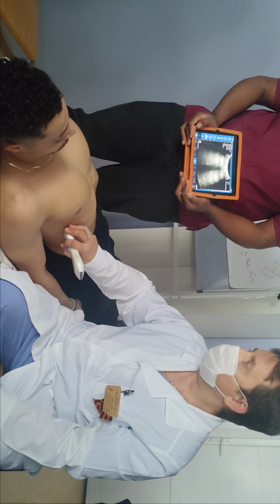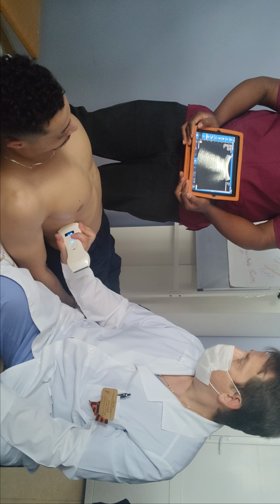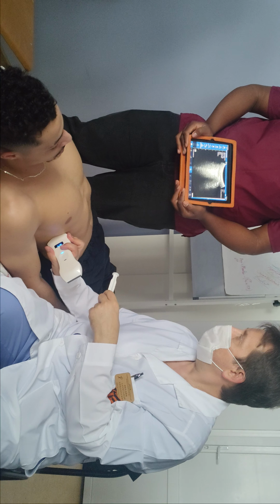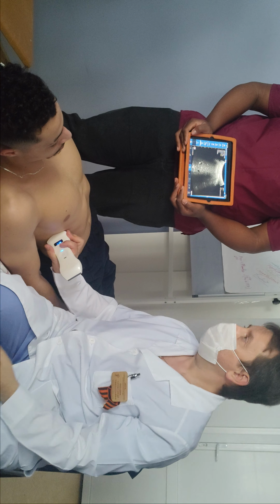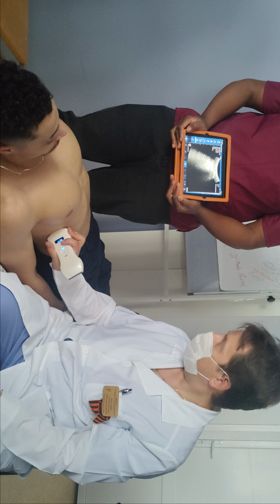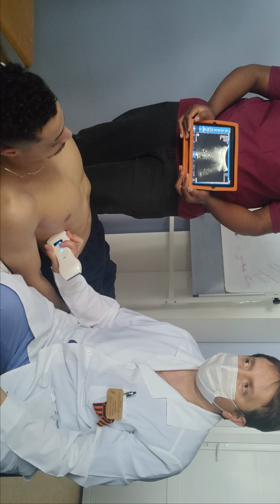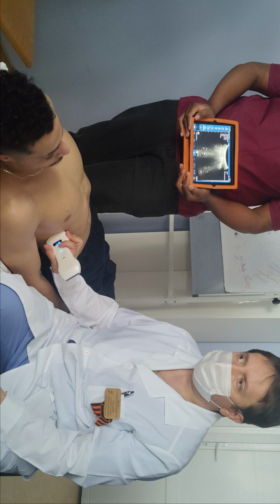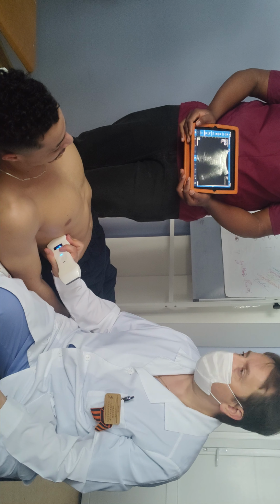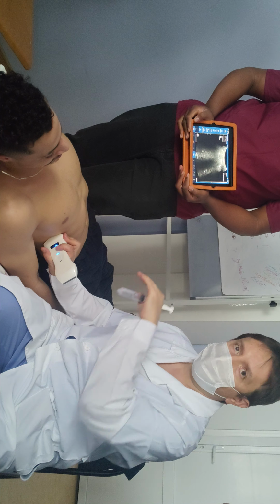It was absent, the lung, and now it is present, the lung. That is lung. Then exhale. No lung. Again. That is lung. Exhale. No lung. It means the touching point of the lung. It is a sign of pneumothorax. It means that all of us have pneumothorax, you remember? But where? In some tiny place. It is just here and from the opposite side.